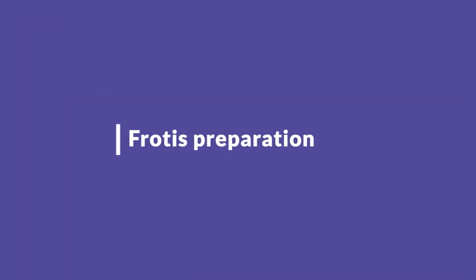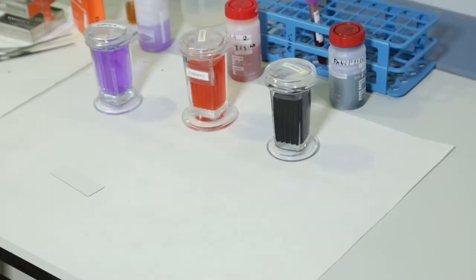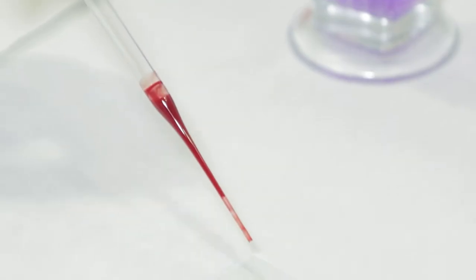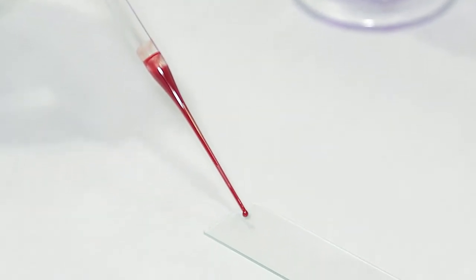Frotis preparation. The blood sample can be either obtained directly from a puncture in the finger with a lancet or by blood extraction collected in a tube with due anticoagulant. Using a Pasteur pipette, a drop of blood is placed close to the edge of the glass slide.